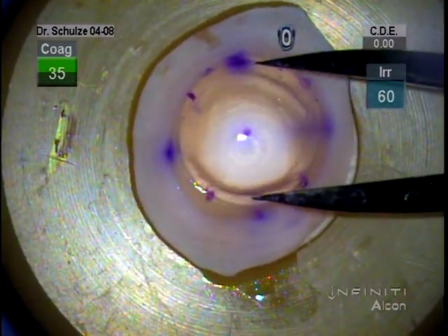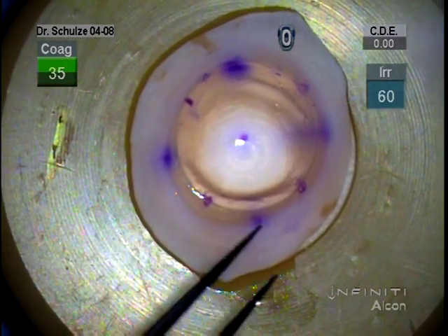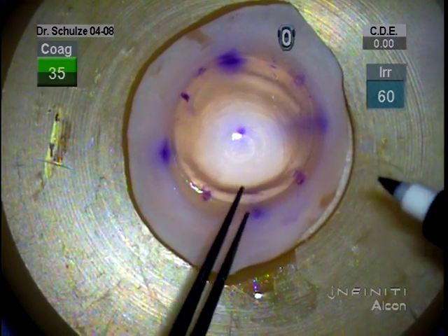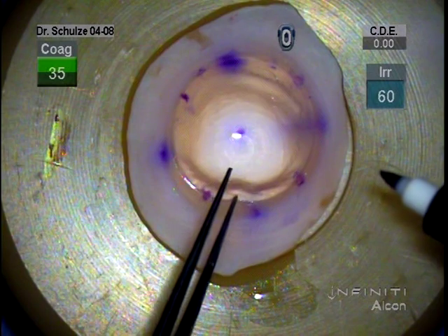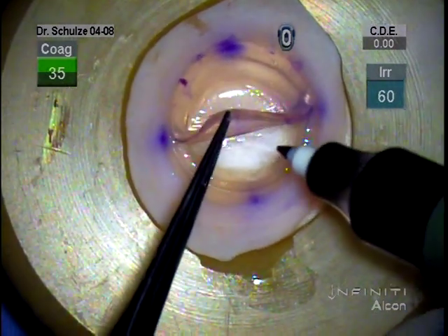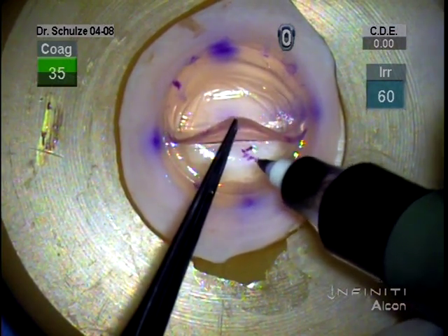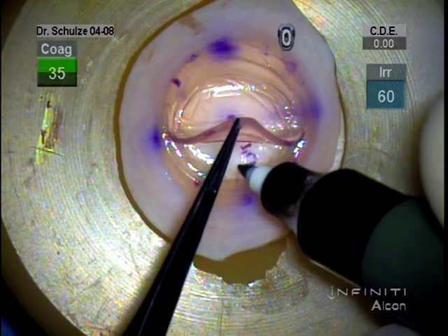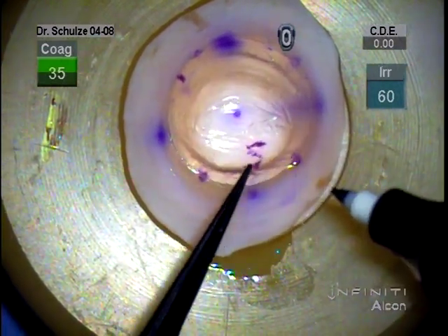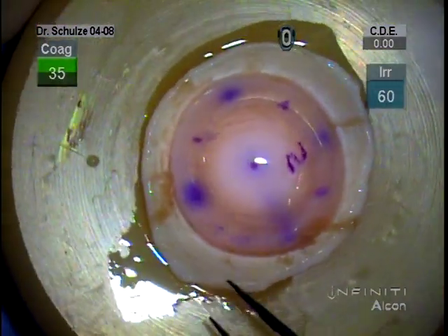I also like to measure the diameter of the resection on the donor trefine. This is a precut tissue, by the way, from the North Carolina eye bank. I do like to measure the diameter to make certain that it's large enough to encompass whatever size trefine I happen to be using. And then I like to place an S on the stromal side of the donor to help aid in orientation once the donor's in the anterior chamber.